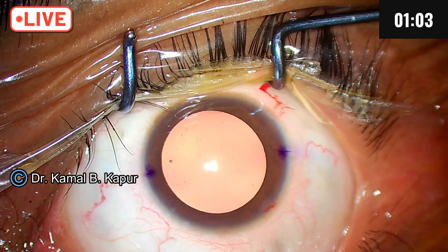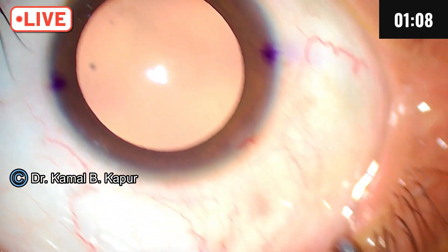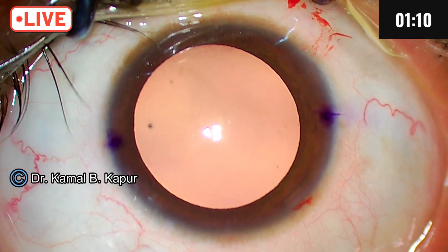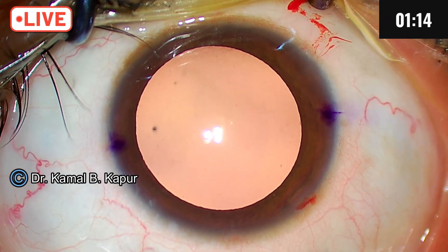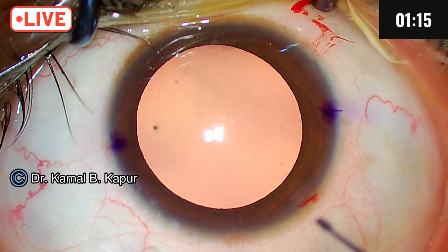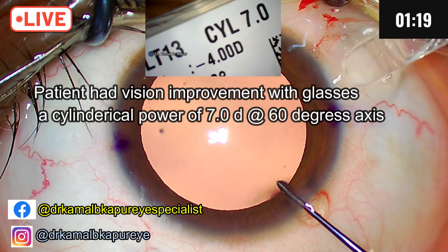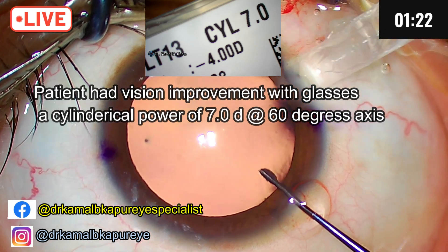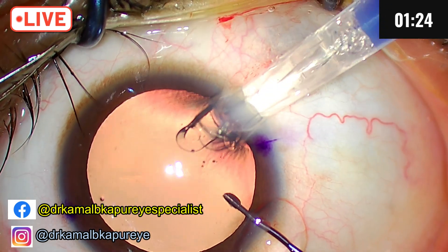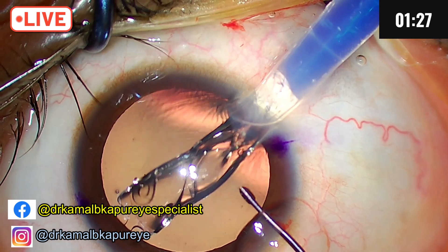Keratoconus patients are fit for a fakic IOL implant in conditions where the astigmatism is regular, the patient shows a significant amount of improvement with glasses on astigmatic correction, and the astigmatism has shown some stability over a period of time.